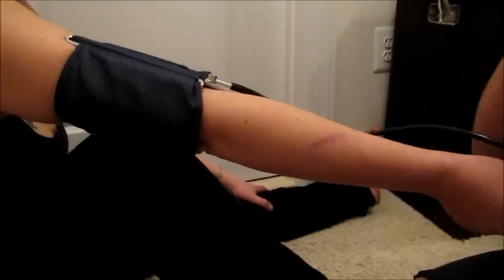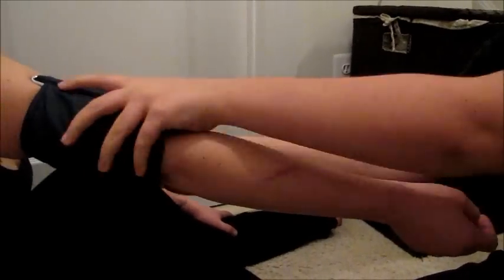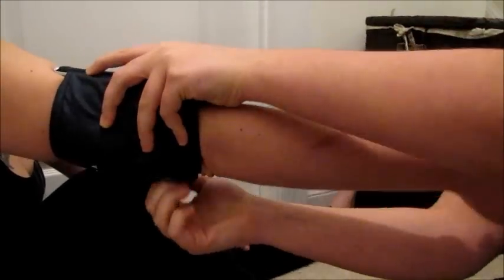Then I will take out my stethoscope, remove the cuff, and I'm done. That's how you take blood pressure.